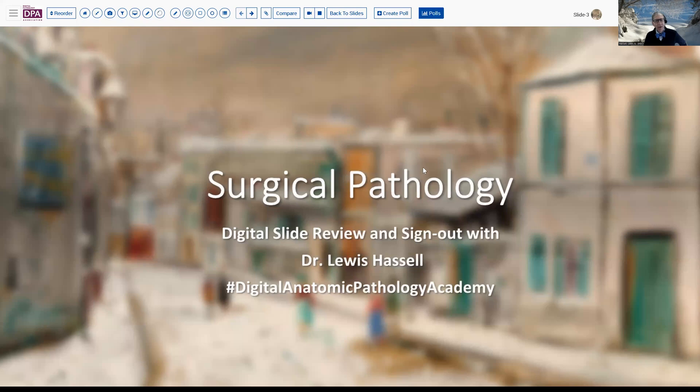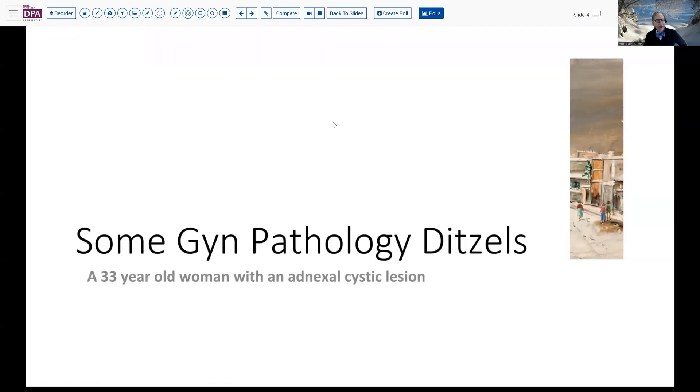Welcome to another in our series of digital slide review and sign-out sessions. I'm Dr. Lewis Hassell, coming to you from the University of Oklahoma Health Sciences Center. Our program is part of the Digital Anatomic Pathology Academy, a joint venture with PATH Presenter and the Digital Pathology Association. Our program today will center around a relatively common question that arises regarding the problem of an adnexal cystic lesion.